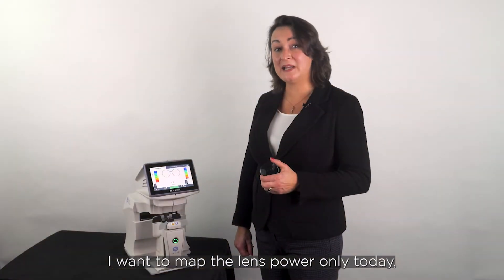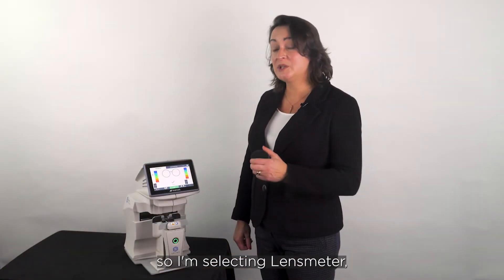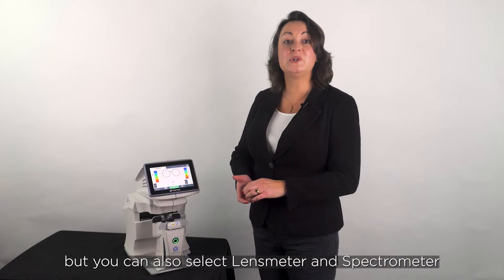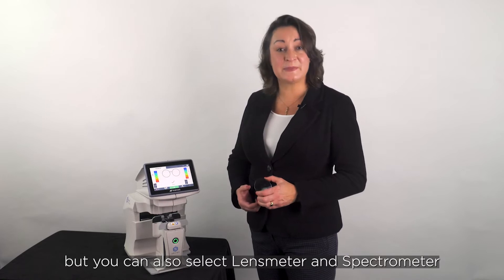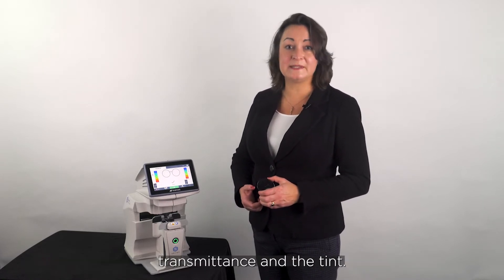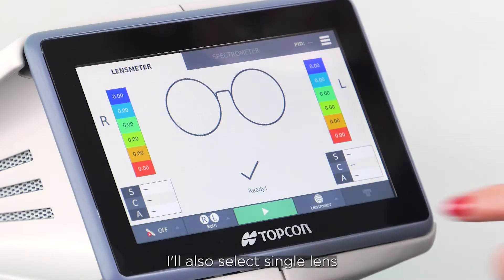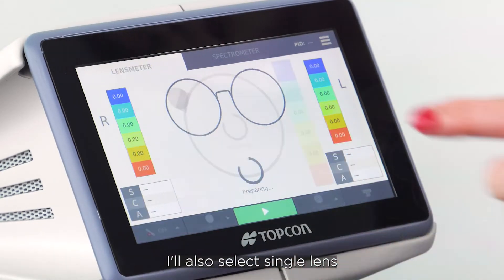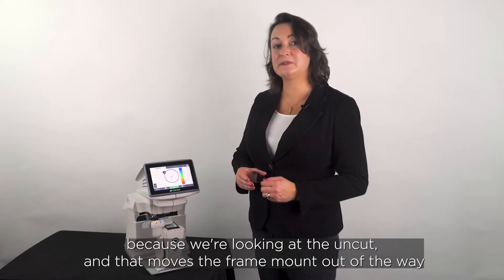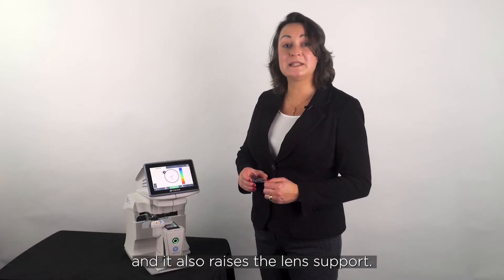I want to map the lens power only today so I'm selecting lens meter, but you can also select lens meter and spectrometer if you want detailed information on the lens transmittance and the tint. I'll also select single lens because we're looking at the uncut, and that moves the frame mount out of the way and also raises the lens support.